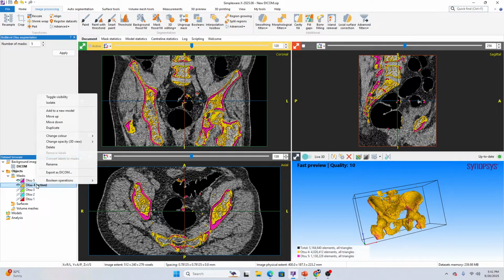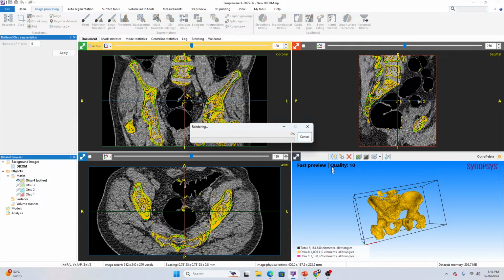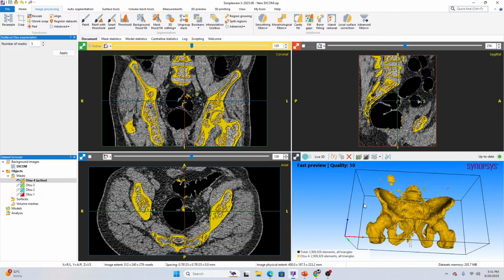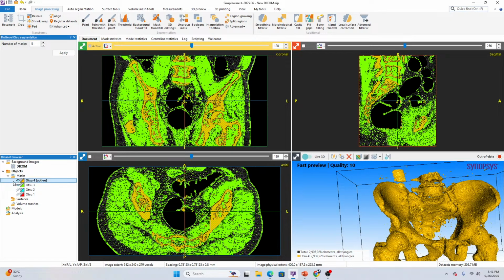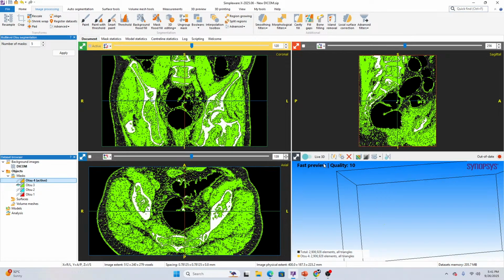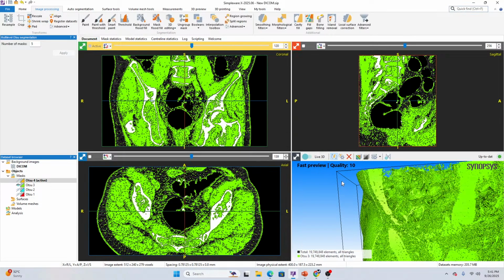For example, if I am only considering the yellow and purple regions, I'll apply a Boolean operation to combine them as a union. So we can use a threshold-based approach to further identify the region. It's a basic approach wherein we can identify the different regions. A muscular region can be segregated from an orthopedic region, and the skin layer can be found. This is one such way that it can be done.